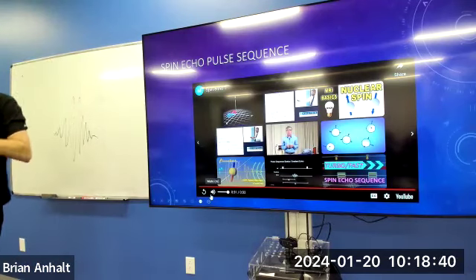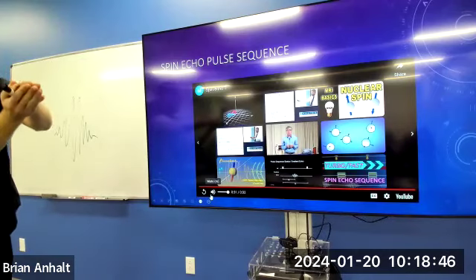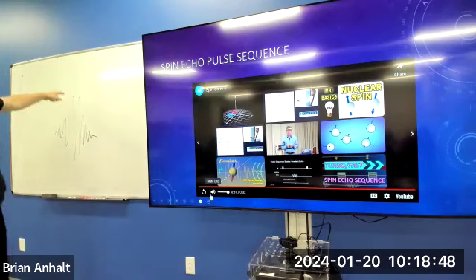Because remember, they're never precessing at the same frequency, they're at different frequencies. They just go out of phase and then we push them back into phase, we refocus them. But they're only gonna be back into phase for a split second until they go back out of phase again. I'll show you one more time.